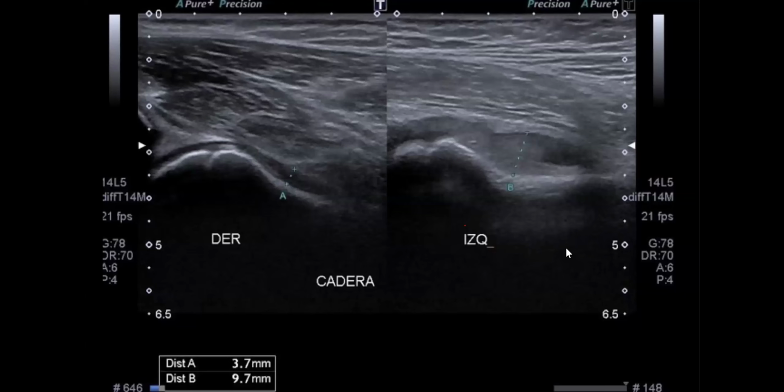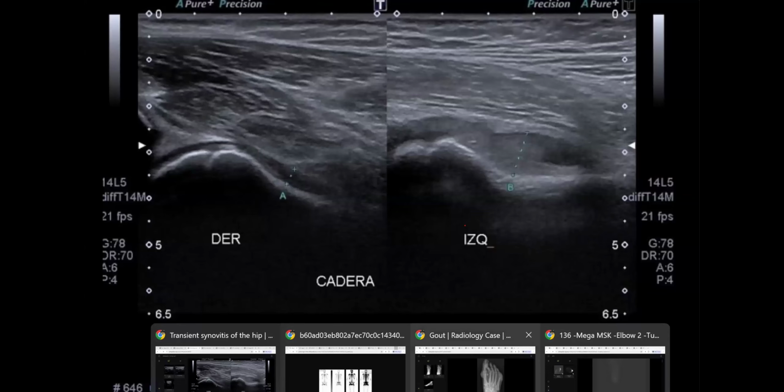Okay, sir. Is there a sign? It has a certain name, like an American president. So Paget's... Abraham Lincoln, sir. Okay, Lincoln. It may be Paget disease, and in young age or in children, also osteopetrosis. You need some revision of the ultrasound and nuclear.